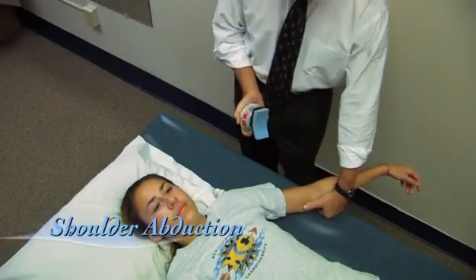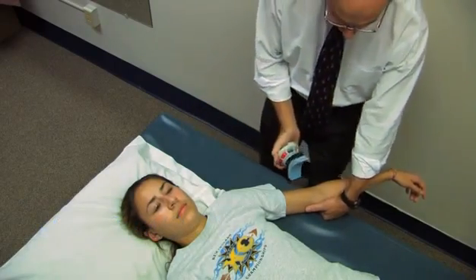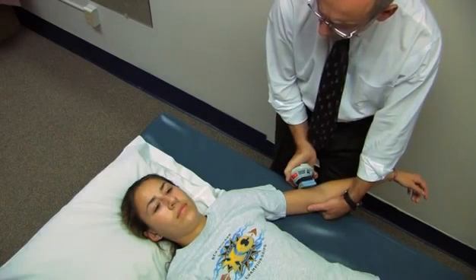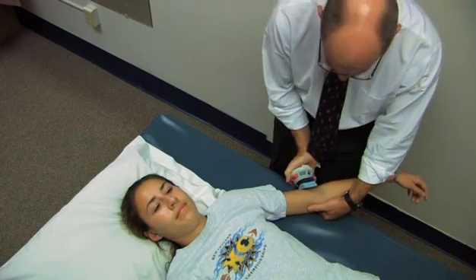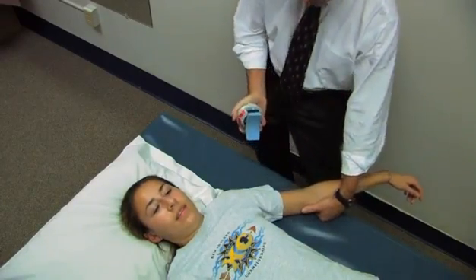Now we're going to measure shoulder abduction. It's done with the shoulder at 45 degrees in the horizontal plane. I'm going to place the device again just proximal to the elbow. When I say go, I want you to take a second or two to come to maximum effort and pull your arm away from your body as hard as you can. Go ahead — harder, harder. And relax. 33 pounds.